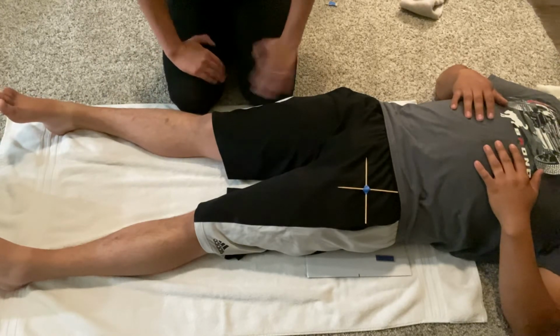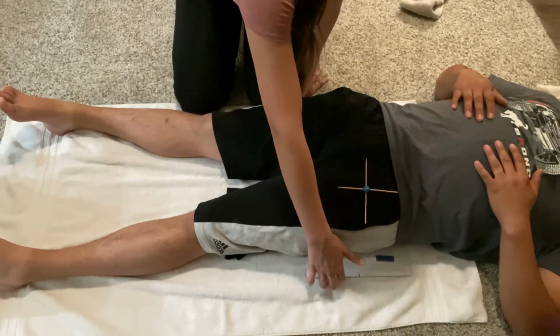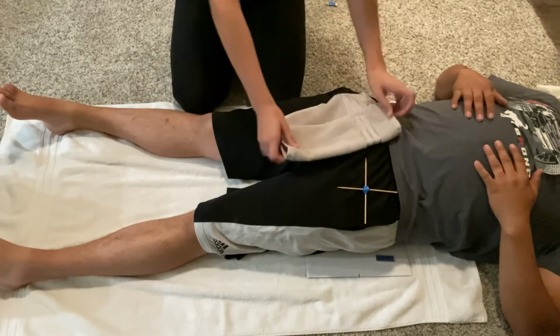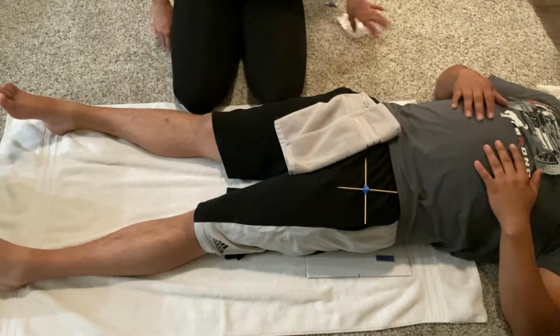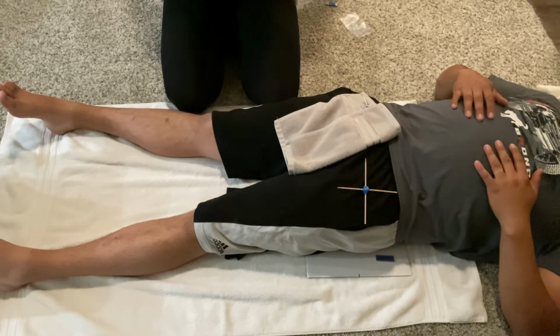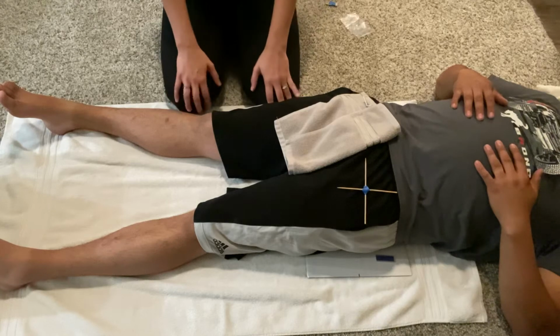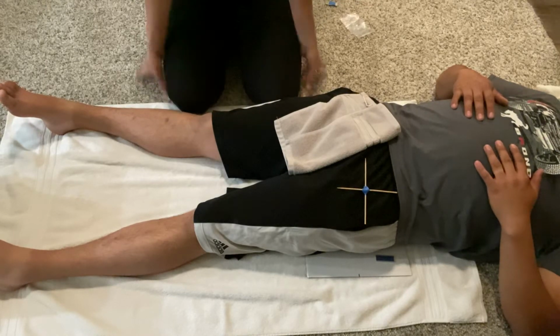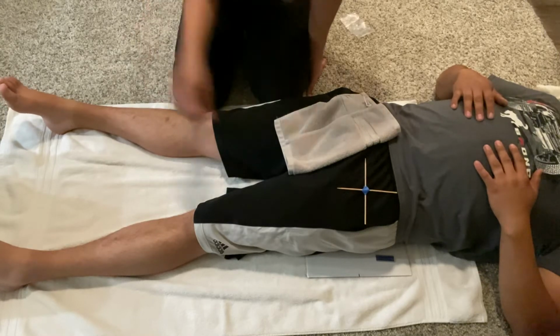Our collimation, we're going to take up the full 10x12 of our cassette. We will shield our patient. We have marked our patient, and for this exam, because it includes the hip, we are going to suspend the respiration. So please hold your breath, and boop, that is the AP hip exam.